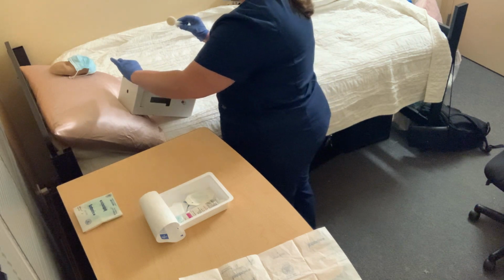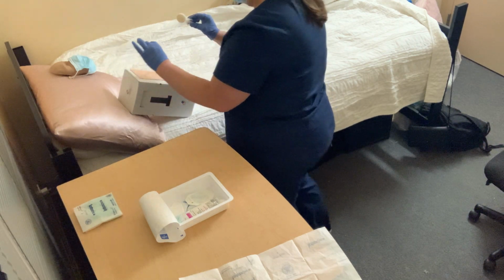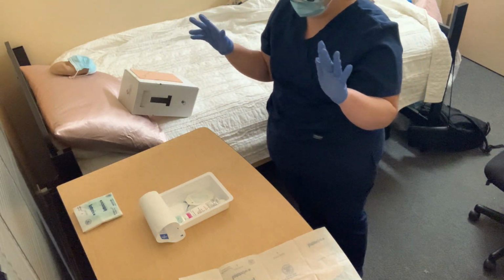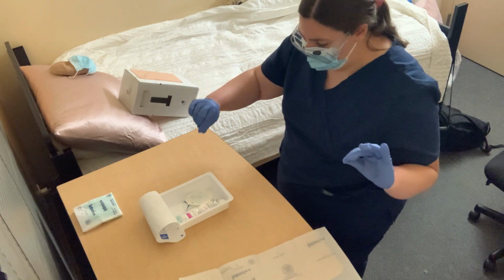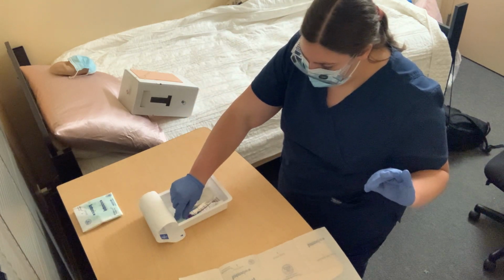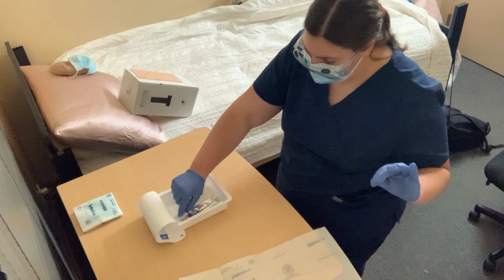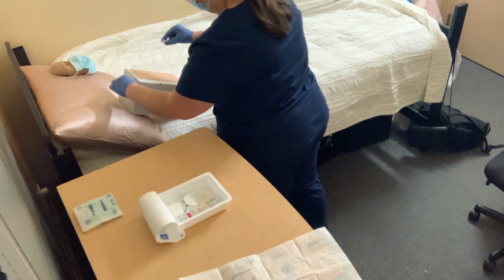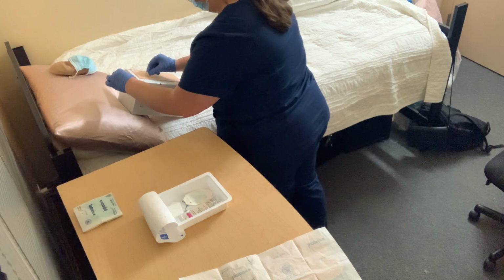All right, so it's been 30 seconds. I'm going to place the tubing down. I'm going to dispose of my chlorhexidine while keeping my hands above my waist. I'm going to go into my tray with my right clean hand and grab my bio patch. I'm going to hold the tubing while I place the bio patch.